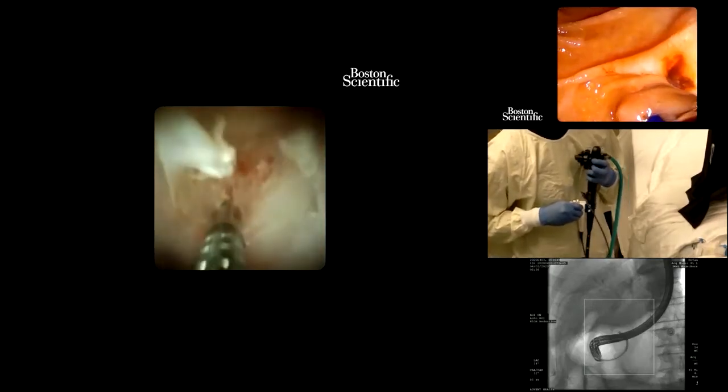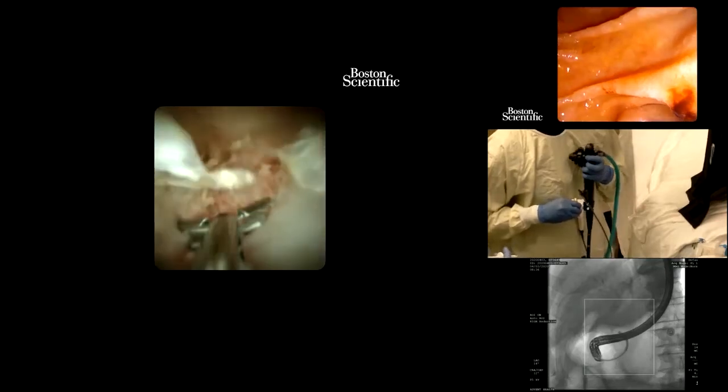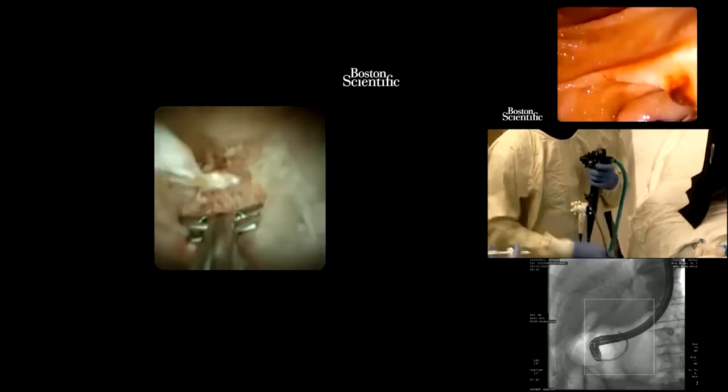I think in 2020, it's important to use SpyBite Max because it's big. It is going to give you more tissue, and the technology has evolved significantly. Not everyone has a pathologist in the room, so you can see how big and wide the jaw of this forceps is. Open. I'm going to push myself in. The technique is important. You push in, and after you do that, you suck as much as you can, and then you advance your SpyBite deep into the tumor. Close. And you can see the pressure on the tissue. And then when you take it out, you get good quality material.